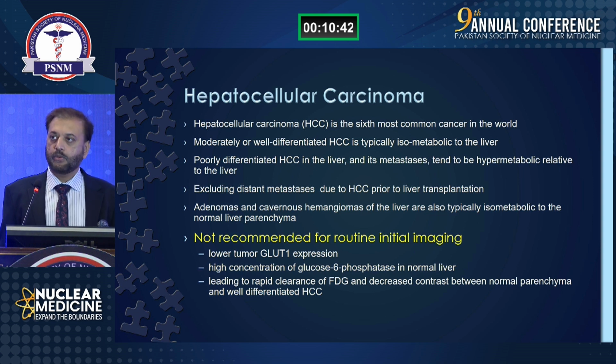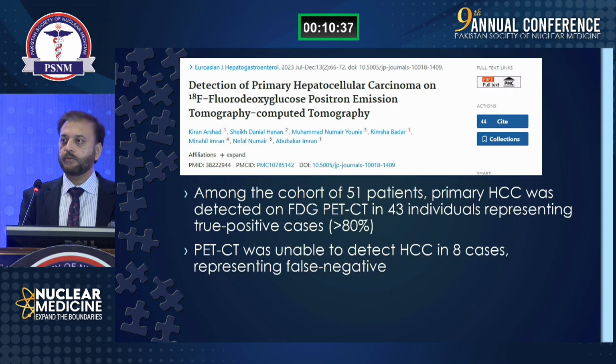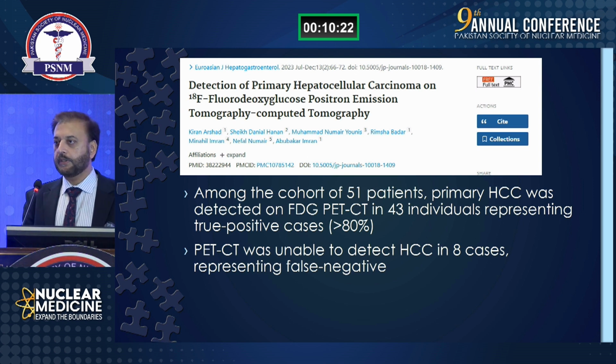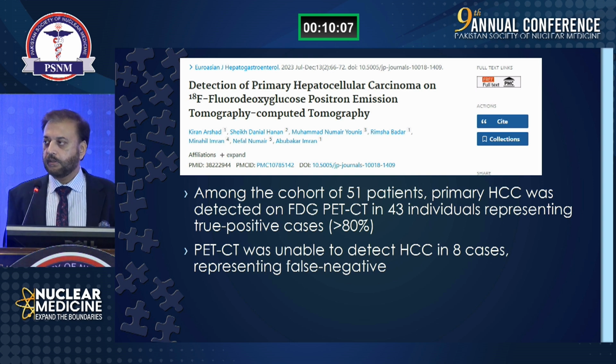Otherwise, FDG PET scan is not routinely recommended. However, in our own experience, we have found that in our patients, this study was published recently and it included 51 patients. We performed PET scan in 51 consecutive patients, and we found that more than 80% of these patients showed positivity. So the sensitivity of FDG PET CT in our population is high, and probably because the disease is either poorly differentiated or multifocal, so it shows higher uptake as compared to that documented in literature.